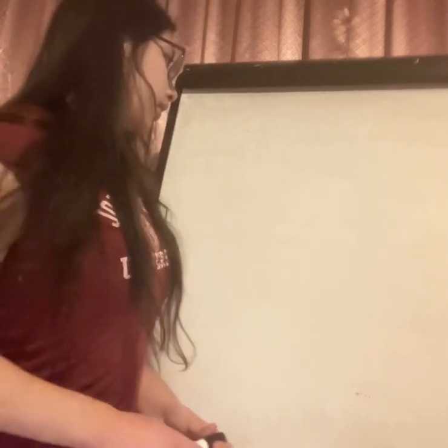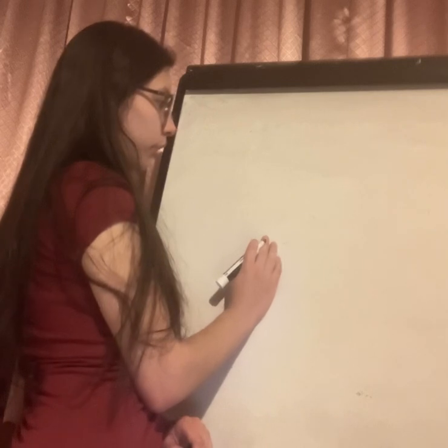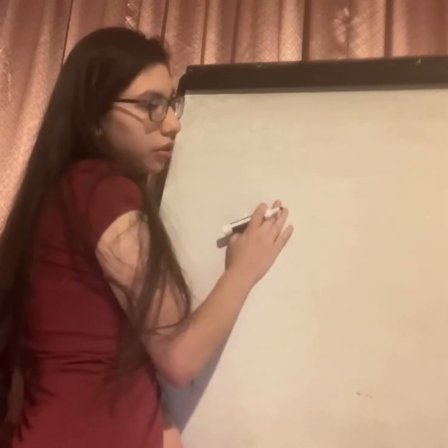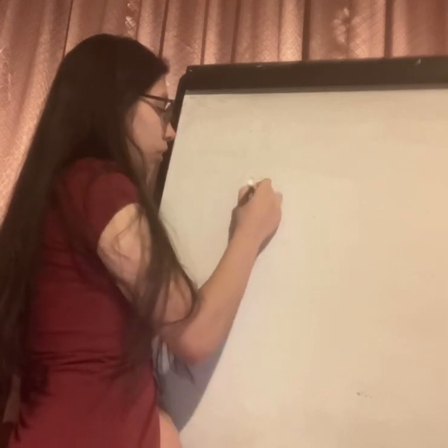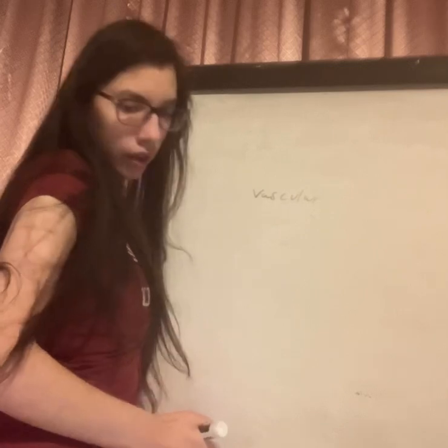Now we're going to see the amygdalectomy in mesial lobe epilepsy. The amygdalectomy is the full removal of the uncus. Which structures or which parts of the uncus are removed depend on the vascular structures that we are seeing.